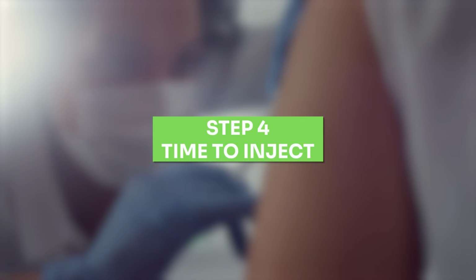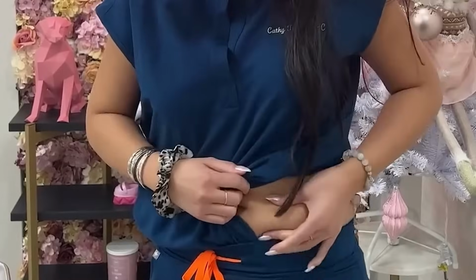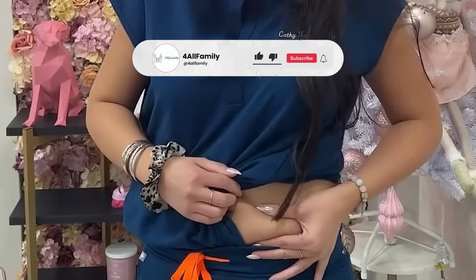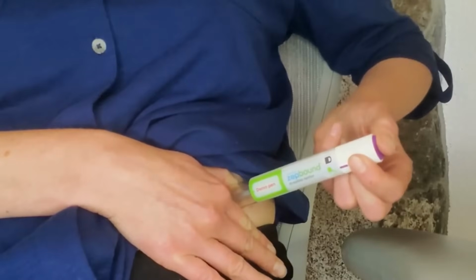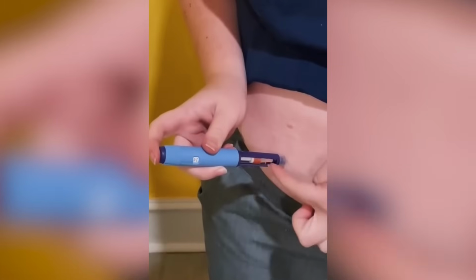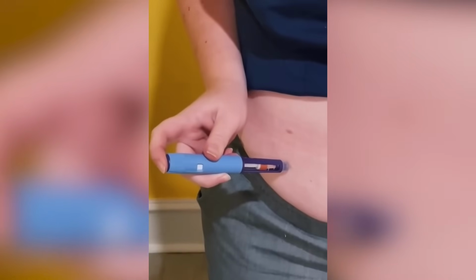Step 4. Time to inject. Find a fatty area, belly, thigh, or upper arm. Gently pinch the skin to lift the fat layer. Stick the needle in at a 90-degree angle. Push the plunger down slowly, no rushing. Keep the needle in place for about 10 seconds so everything gets absorbed and the medication is fully injected.